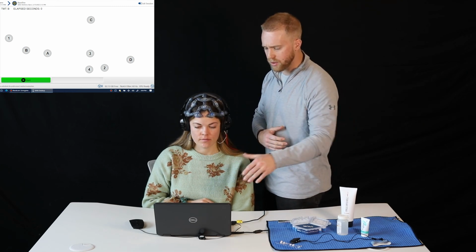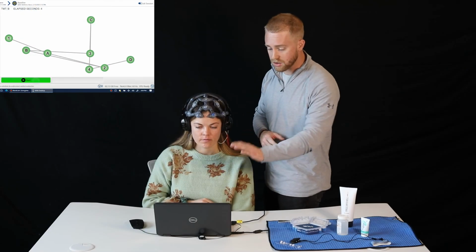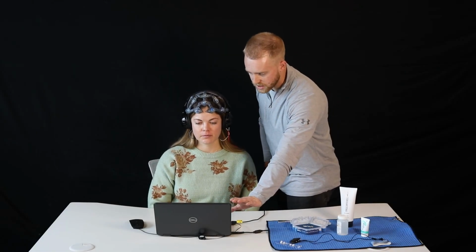We will start with another practice screen. If you're ready, you can go ahead and click start. Okay, perfect. So now we've completed the WAVi wellness test, and we'll move into the reports.